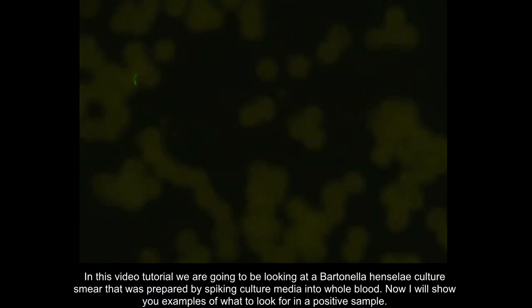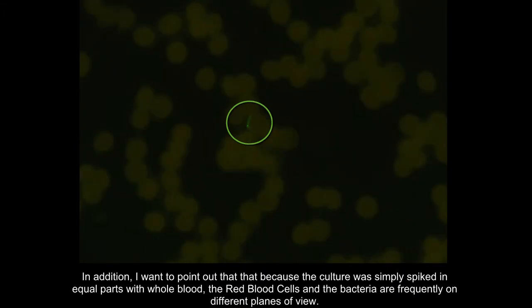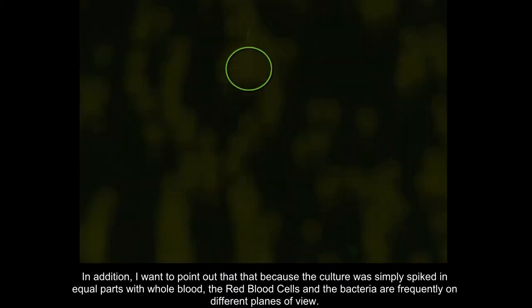Now I will show you examples of what to look for in a positive sample. I also want to give some examples of artifacts versus true signals. I will denote the true signals with green circles and the artifacts or anything else indistinguishable in red.